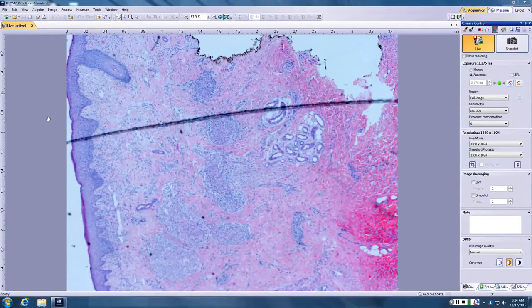It made all the papers, CDC's involved, and the point that the dermatopathologist who is reporting it is making is that this is not a spike in incidence, this is a spike in recognition. These people have been out there. It's tuberculoid disease, it's getting called sarcoid, it's being mistreated, and it's common. It's just being missed. So granulomas, horizontal, parallel to the surface, following the neurovascular bundle, think leprosy.